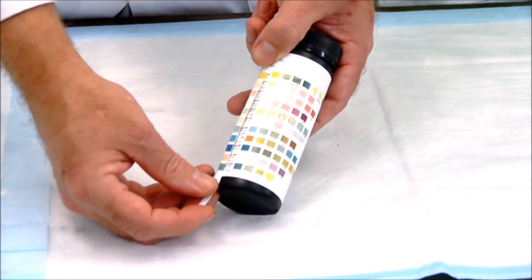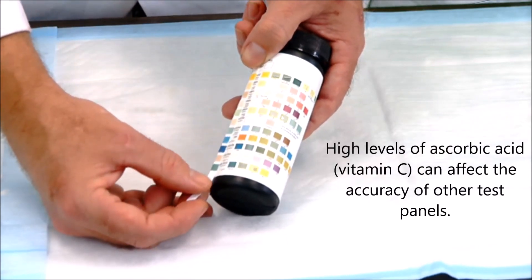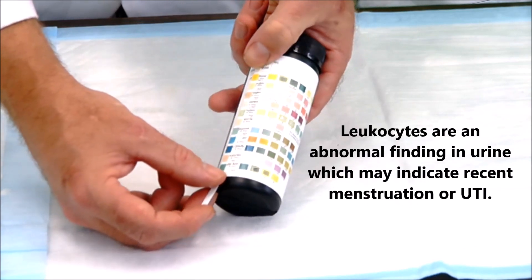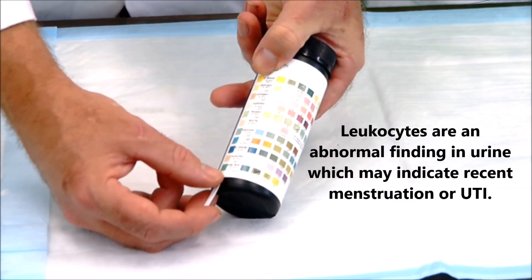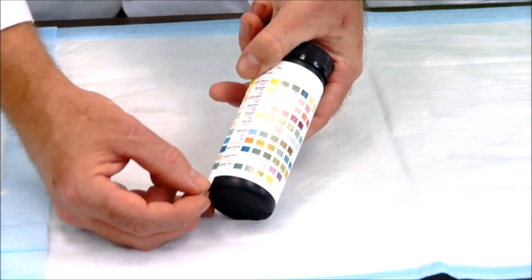So first, let's go from the bottom. You can see that ascorbic acid looks like I have a 10 there, so I'll mark that down. Next is leukocytes. This would be abnormal to have in urine, but it sometimes happens in females or people with urinary tract infections. You can see that I might have a trace of leukocytes in this urine. This is actually synthetic urine, by the way.